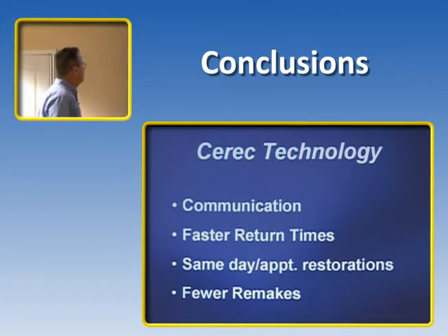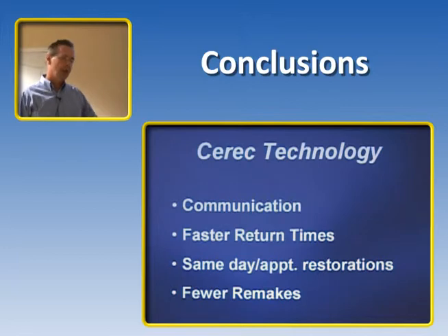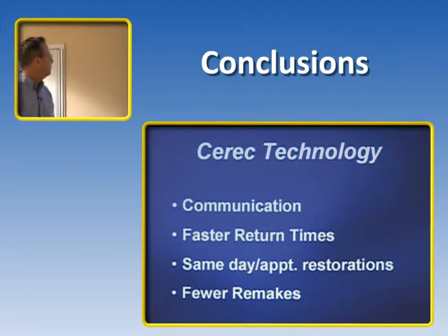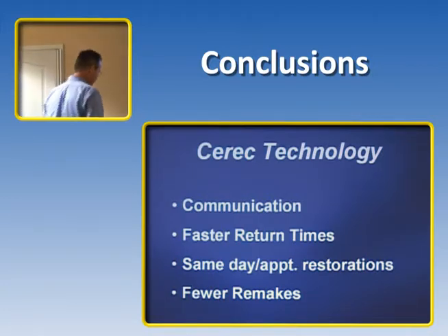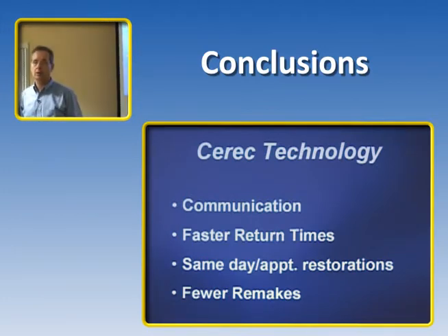Fast return times, yeah, we look towards the future as we start to grow our resources as a laboratory, being able to cut down the times on all cases. We talked today about same-day appointments. I think this last one is the biggest key, which is fewer remakes, okay?